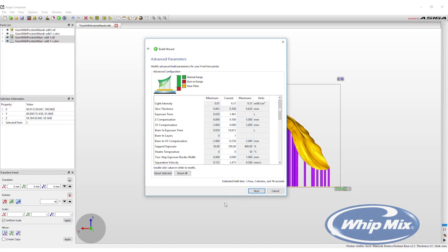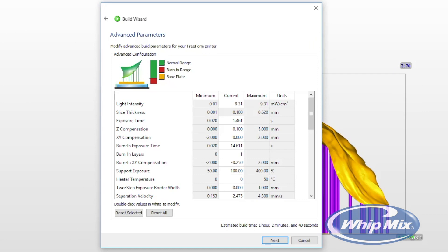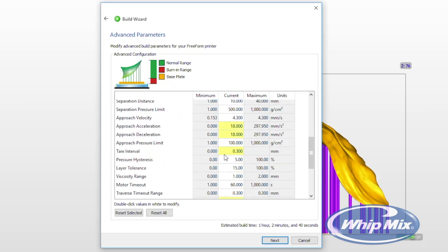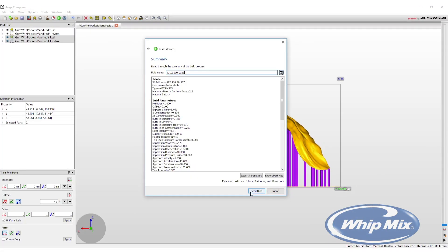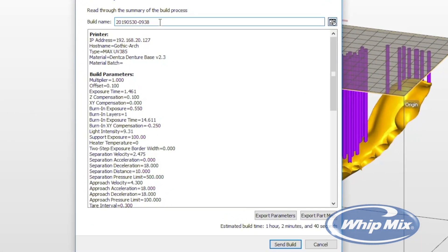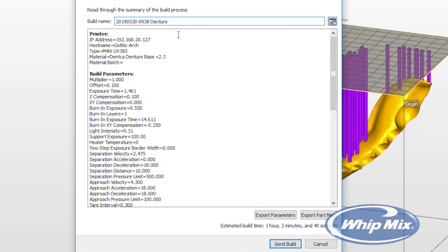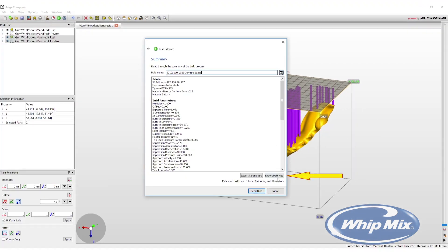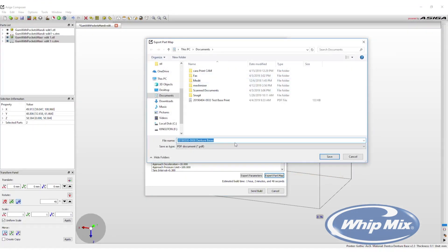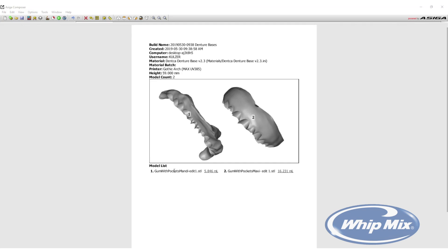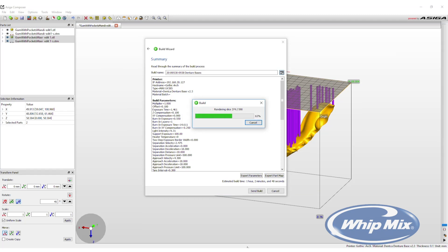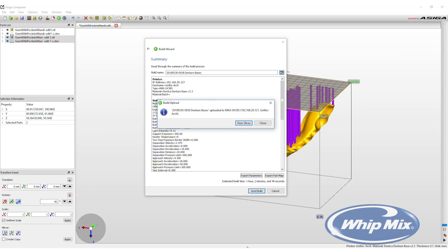The advanced parameters window will open, allowing changes to any aspect of the print. Numbers highlighted in yellow indicate that Fast Print Mode is activated. These settings will normally never have to be changed. After selecting Next again, a summary page appears where the print job can be named — the default name is the time and date. The name can be changed to the user's preference. This page also has the option to export the part map, a PDF summarizing the current print job. Finally, click Send Build. The computer will take the three-dimensional images, create them into slices or layers, and submit them to the printer.